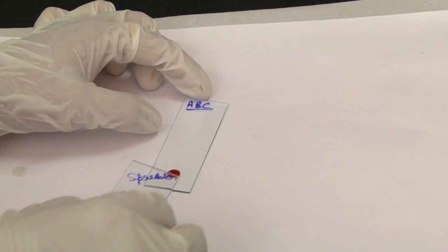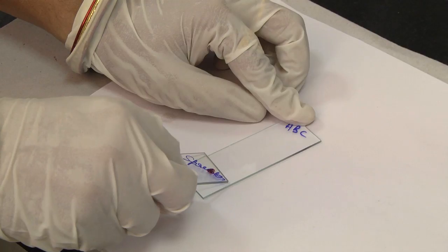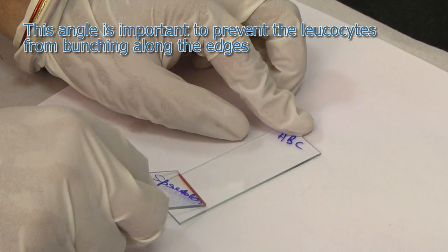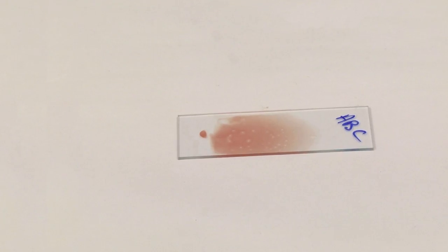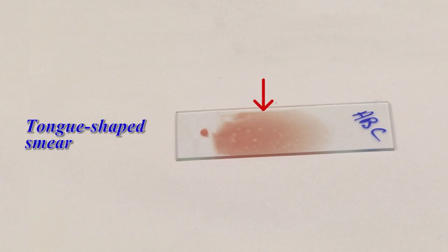Place a drop of blood on one edge of a clean, grease-free glass slide. Place another slide at a 30 to 45 degree angle up to the drop, allowing the drop to spread along the contact line of the two slides. This angle is important to prevent the leukocytes from bunching along the edges. Quickly push the upper slide toward the other end of the lower slide.